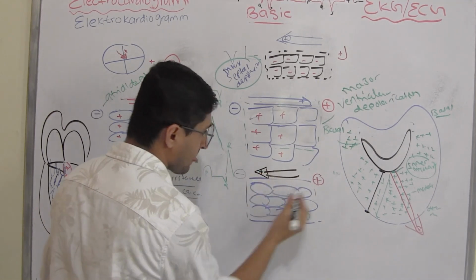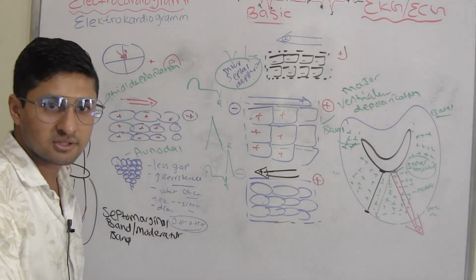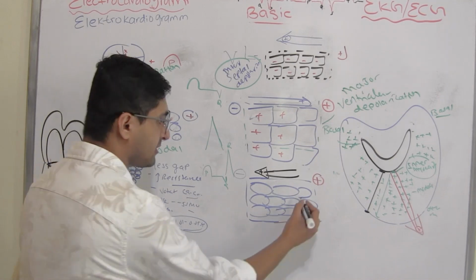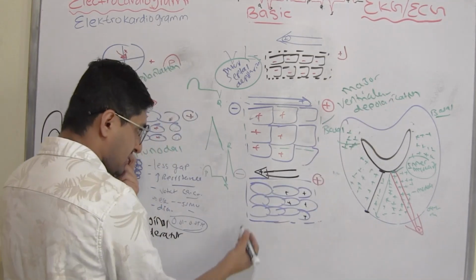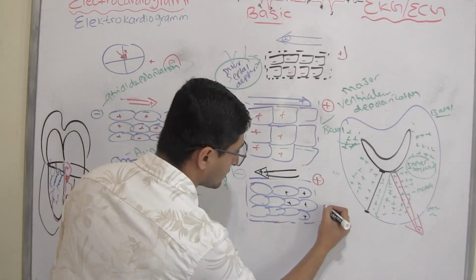Okay, obviously positive, but because it's going away from this positive direction, what's going to happen? It'll have a negative deflection or positive deflection? Obviously, if it's going away from the positive direction, it's simple, right? It is getting depressed from this direction, upward to the right. Because that is up, it will obviously have a negative deflection, right? So that way you will see another wave.